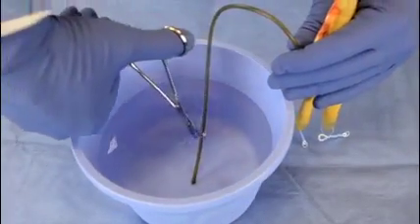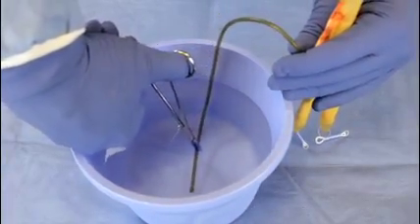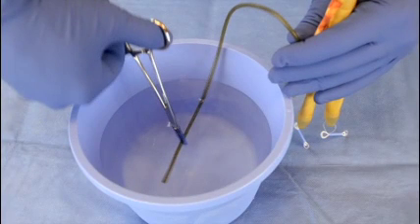With the black tubing still in the saline, using a blue shod mosquito hemostat, clamp 1 notch only the black tubing 1 inch from the open end. Do not advance the hemostat ratchet more than 1 notch. Excessive pressure will permanently damage the tubing.